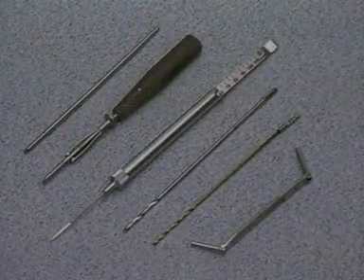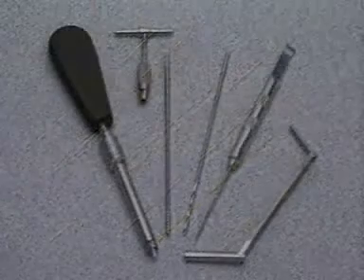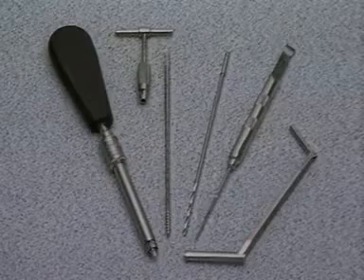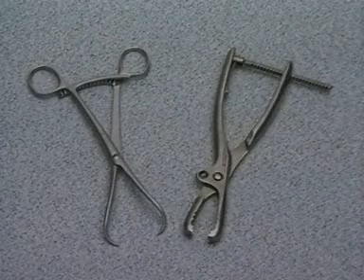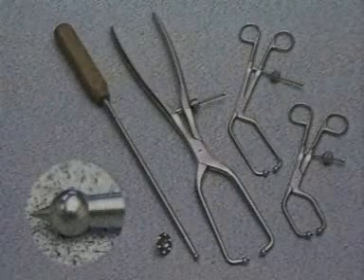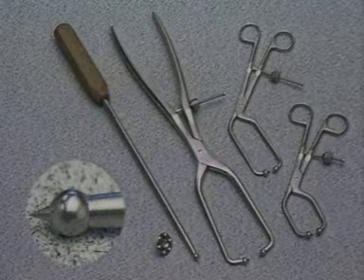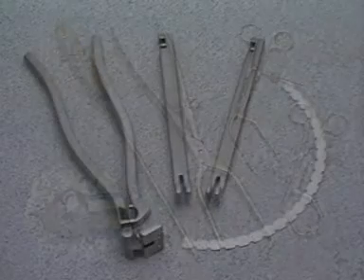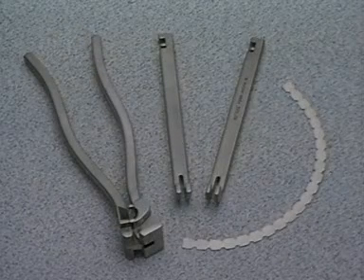For this exercise, we'll use part of the 3.5 instrument set. These are the needed instruments for insertion of the 6mm Schanz screw. We also use the pointed reduction forceps and the Farabeuf clamp. These are the necessary pointed ball-tipped instruments, the bone-holding rod with spiked disc, and three various pelvic reduction forceps. The template serves as a model for bending the plate with the bending pliers for reconstruction plates and the bending iron.